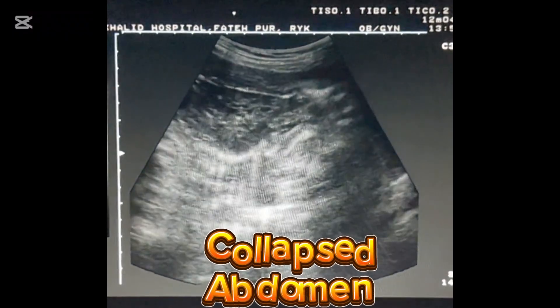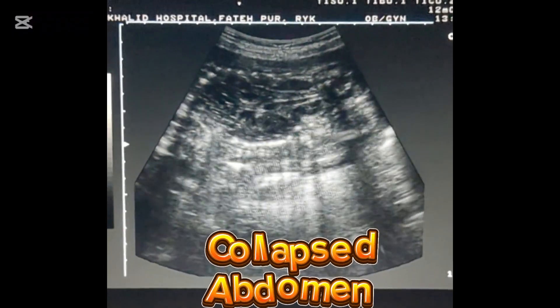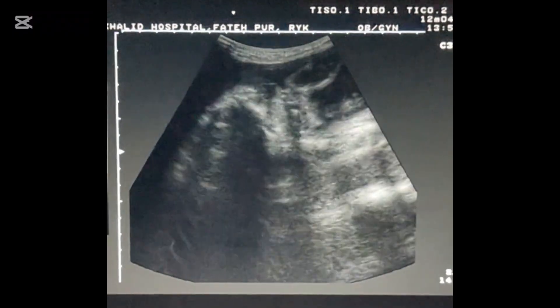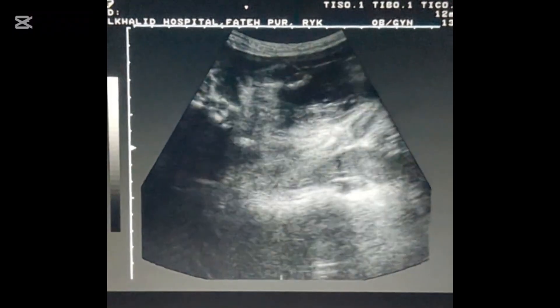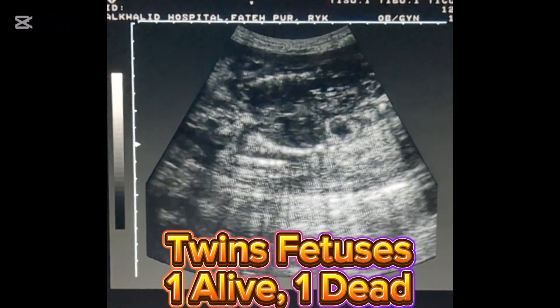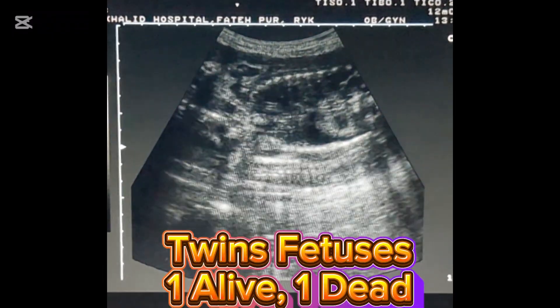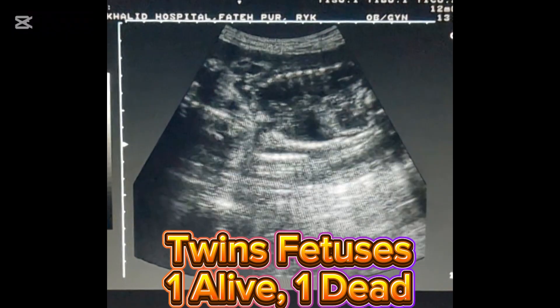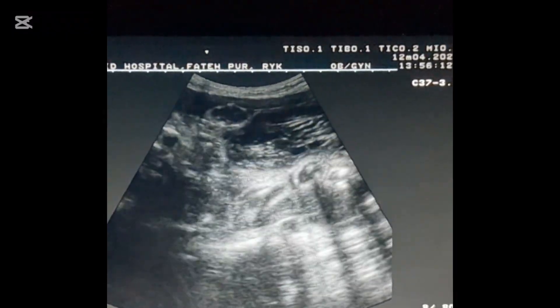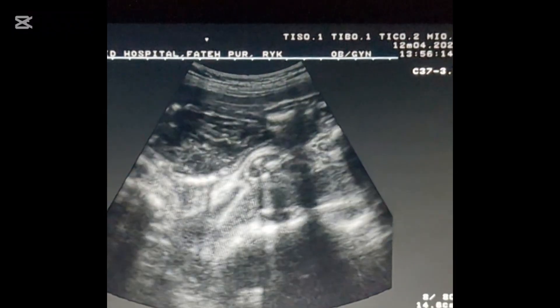The abdomen is also collapsed. This pregnancy has low liquor. These are monochorionic fetuses with a single placenta.